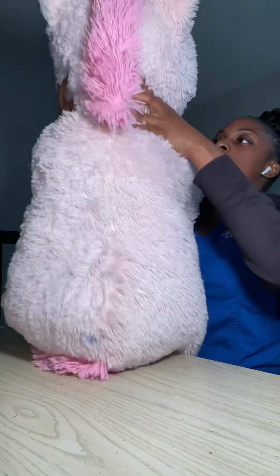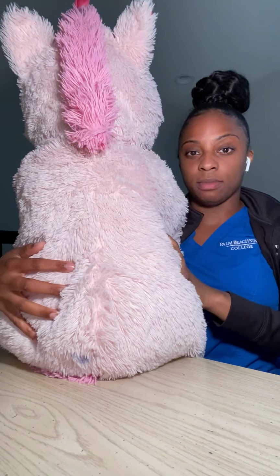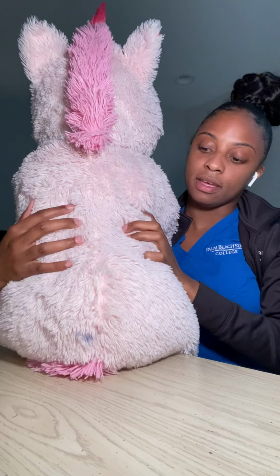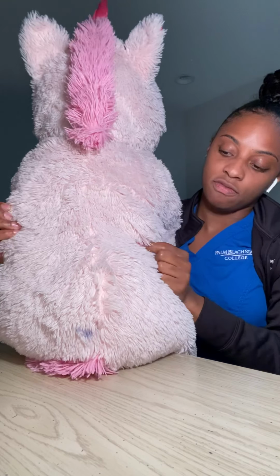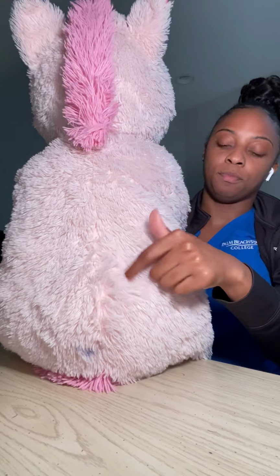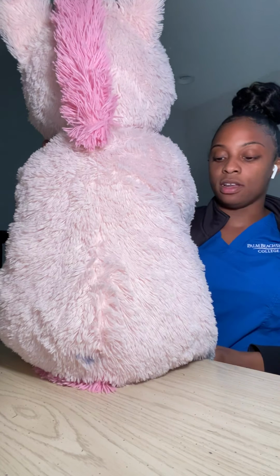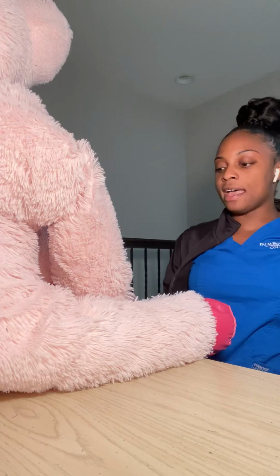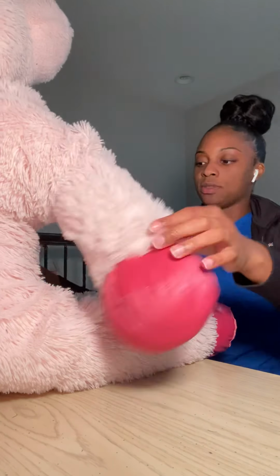And I'm going to let her know what exactly the doctor is going to be doing, but on her back it's going to be some betadine here, and it's going to be a pressure sensation feeling going in. It's not necessarily pain where the actual epidural catheter is going to be inserted. So I would go ahead and make sure I make my patient aware of that. And that's what the physician's going to be doing.